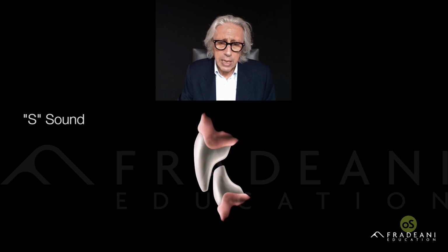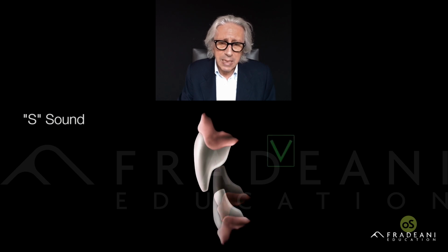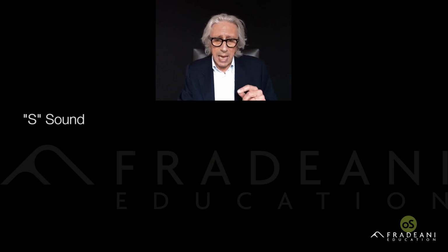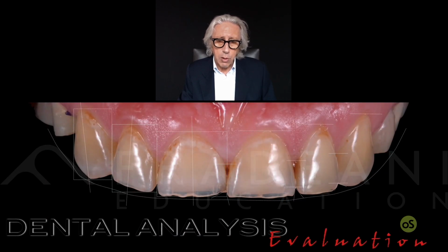You have no contact, but you still have the possibility to increase the balcony and to have more thickness of the palatal part of the upper teeth. At this point, you still have the contact. At this point, you have not lost the anterior guidance. And that is maybe the solution, if you have at the same time the possibility to work on the upper and the lower. So, going back to the lady, she is happy with the new case.